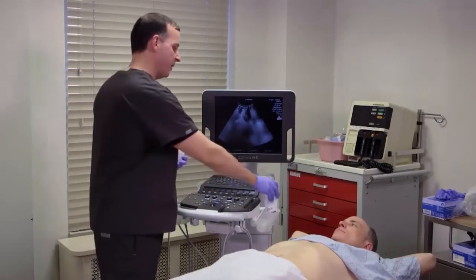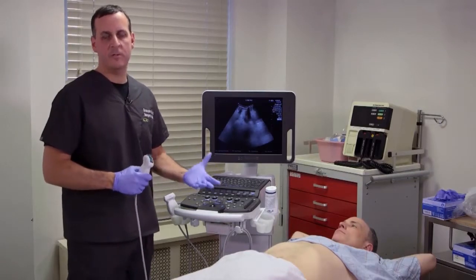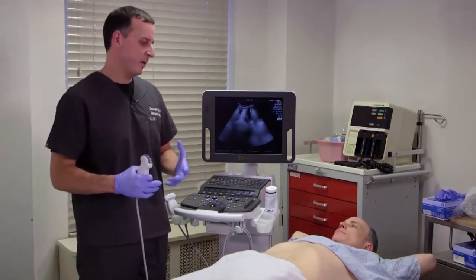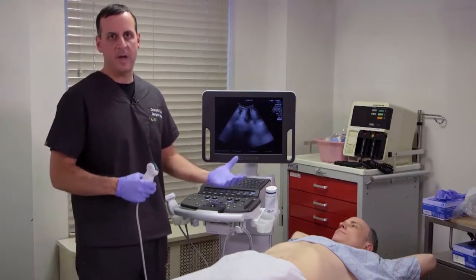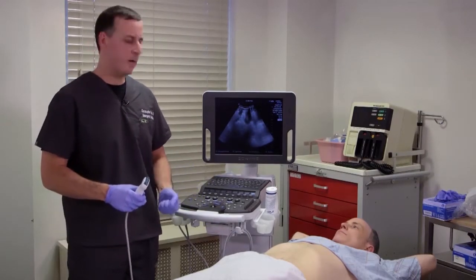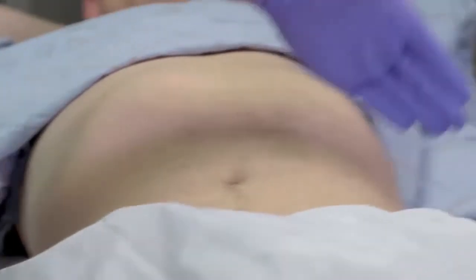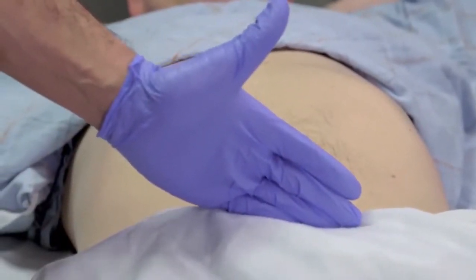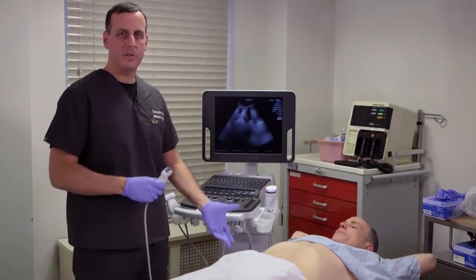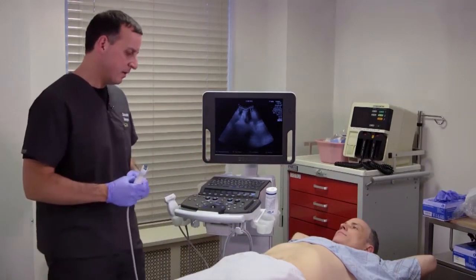We're going to start on the intra-abdominal portion. Some clinicians like to start with the cardiac views because if something is truly emergent and life-threatening, it's really going to be a pericardial effusion and tamponade. Others, like myself, prefer to start with the right upper quadrant view — that's the most dependent portion of the abdomen and probably the most likely spot to find pathology. So I like to start with the right upper quadrant, moving to the left upper quadrant, then the pelvic view, and then above the diaphragm to look at the lungs and heart. In adults, the RUQ is most dependent; in kids, that's the pelvic view.